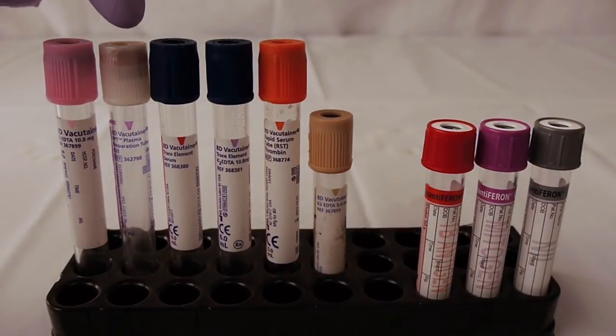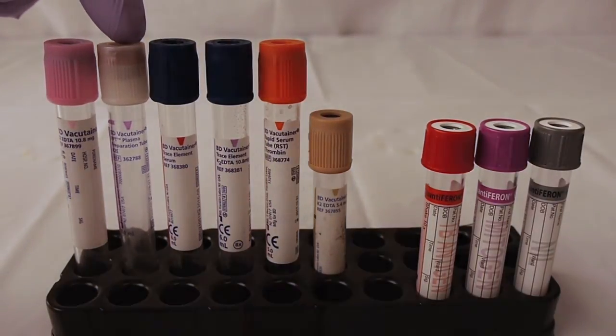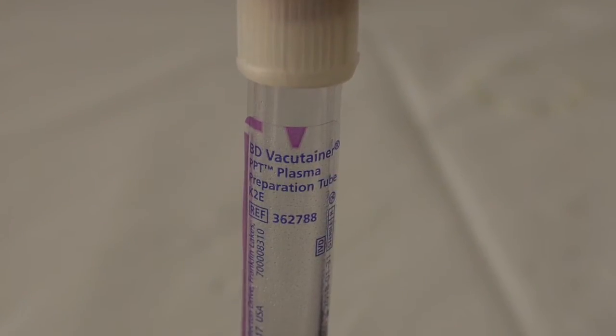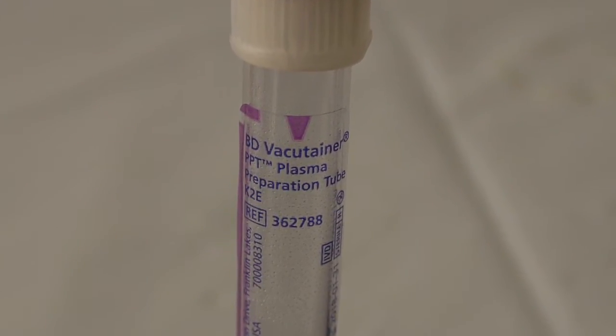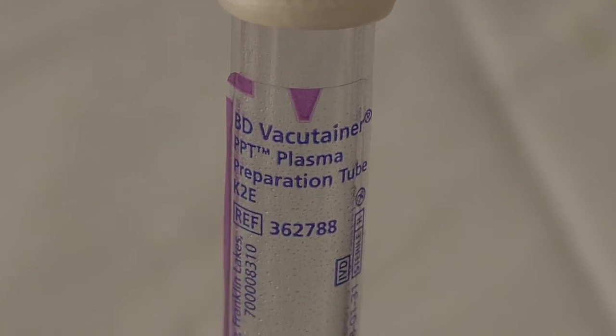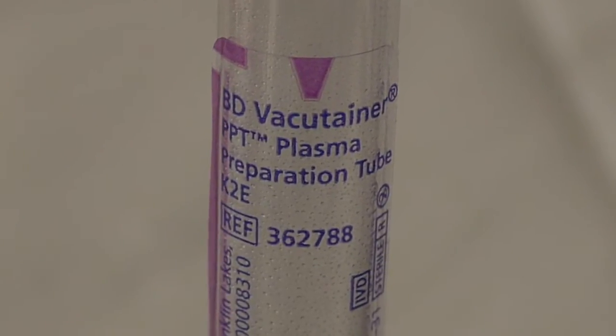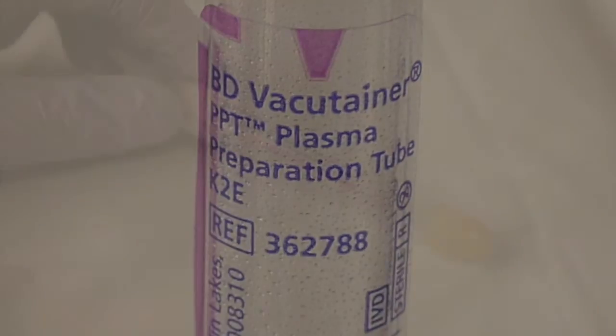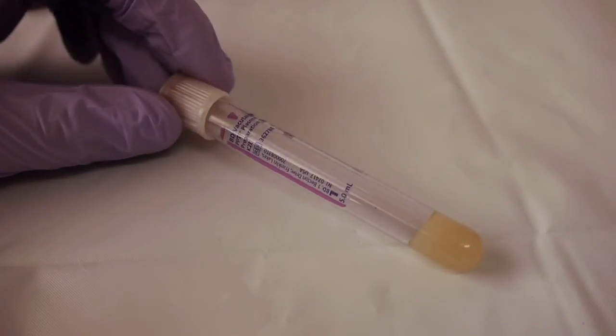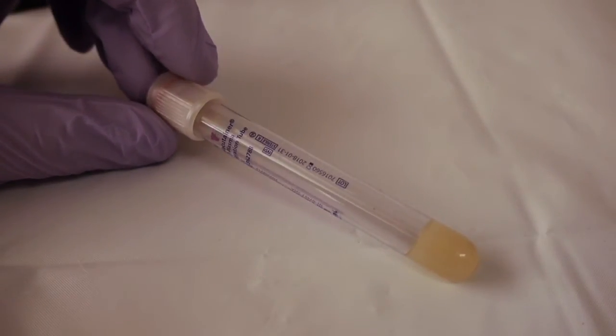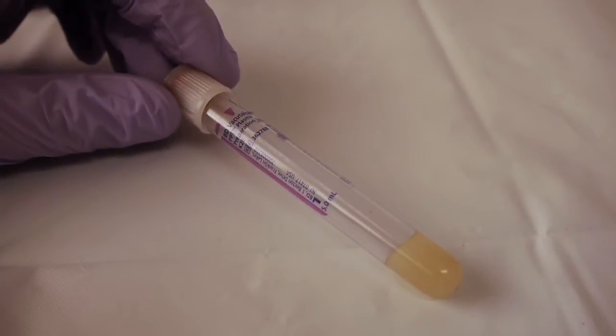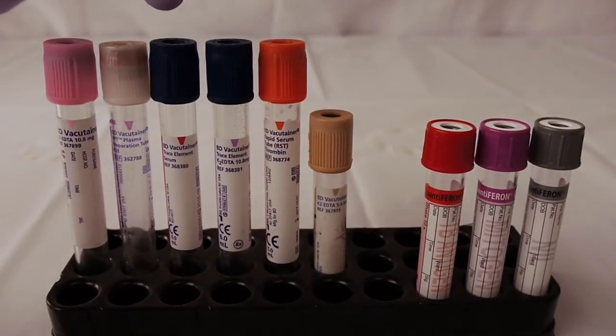The next tube that we have is the Pearl, also known as the Pearl White. This tube has EDTA. It is known as a PPT or Plasma Preparation Tube. This tube has a gel barrier, and it is used for DNA.